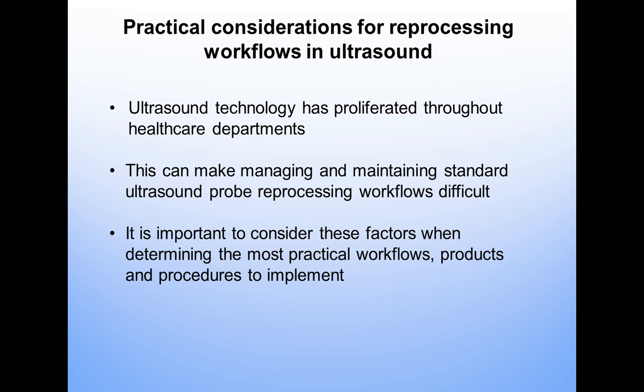And if we think about 20 years ago, the frequency of ultrasound being used to guide a central venous catheter placement was very low. And these days, it is much more common. So we've seen ultrasound be used to guide a lot of invasive procedures. It is a low-risk imaging modality versus radiological-based imaging techniques. And so it's also very convenient, and it improves clinical outcomes.